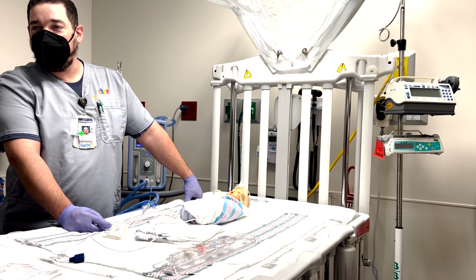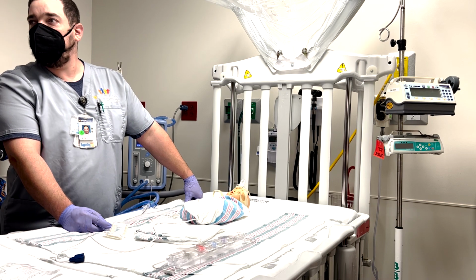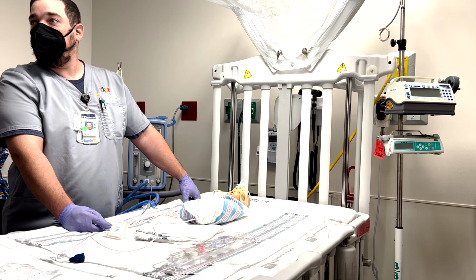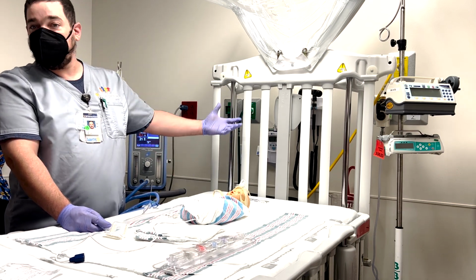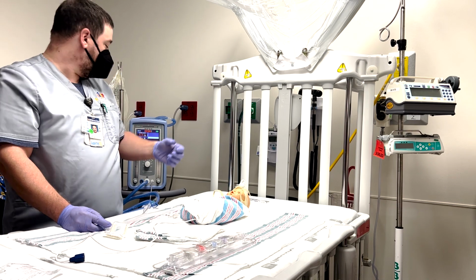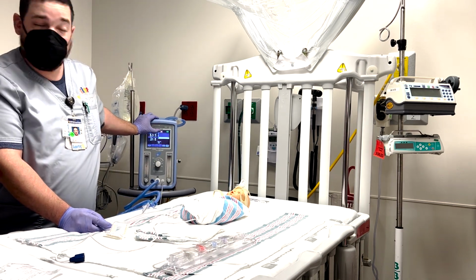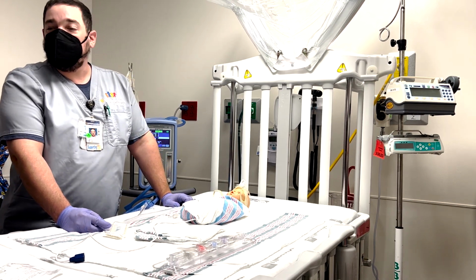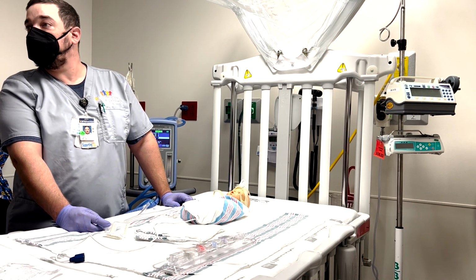Asthmatics, I don't know that I would want to turn anybody with bronchiolitis around up here, because it's an obstructive process. I mean, yeah, it could buy you time, but it could also increase your problem. So again, you can get everything in, but can't get anything out. Oh, I'm sorry. Now I'm going to reset the alarm. But we can buy you some time with a Trilogy.